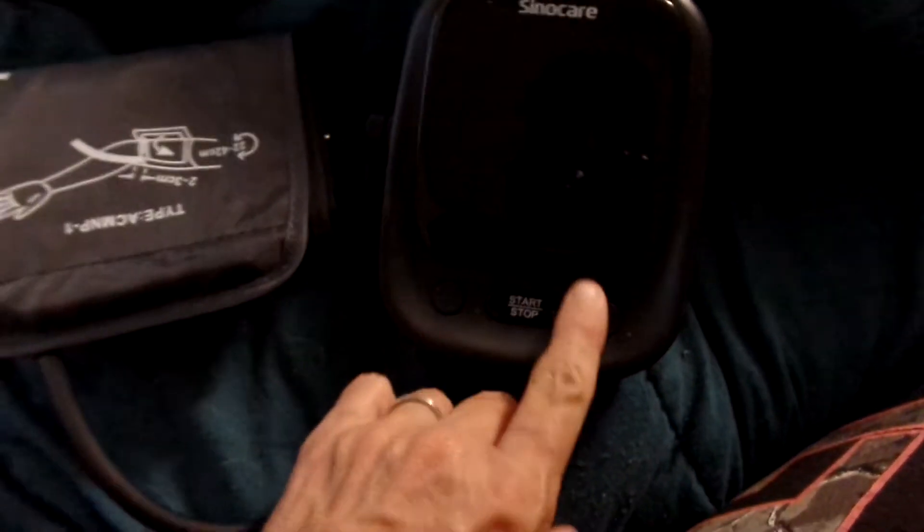I like this one because it has a blood pressure cuff to go on the arm rather than going on the wrist. It talks to you.